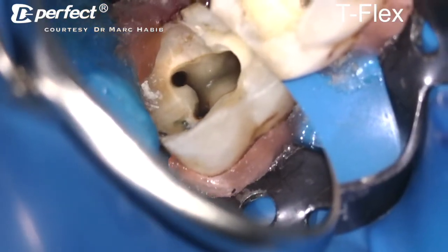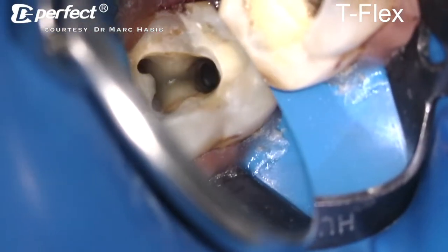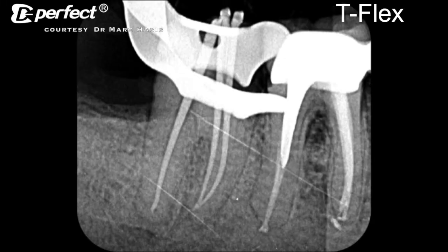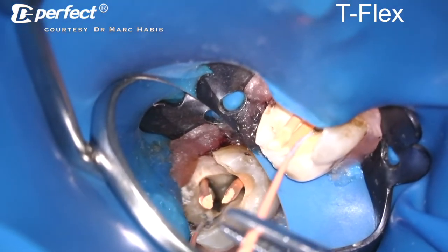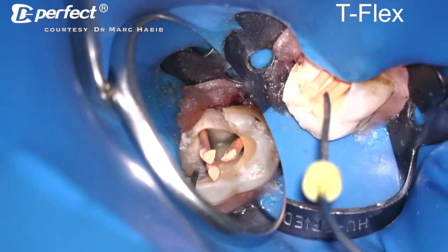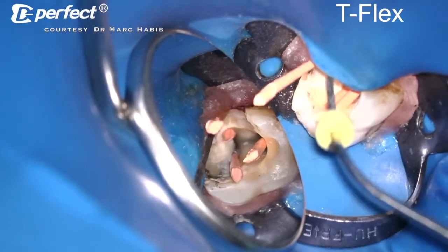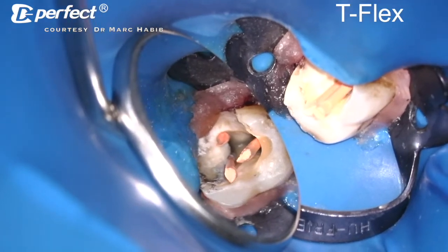We have the access cavity after cleaning and shaping and drying. And after fitting the 3 master cones, we start our obturation phase. Here we have the 3 master cones in the canals with sealer, and we are starting our warm vertical compaction step. So we are heating the entry of the canal to make a coronal plug.